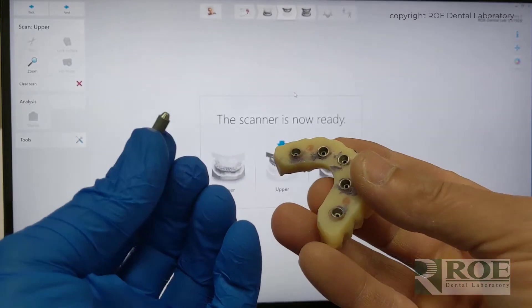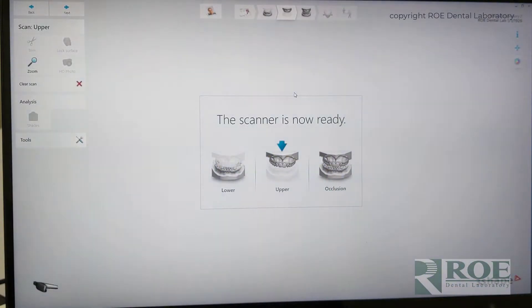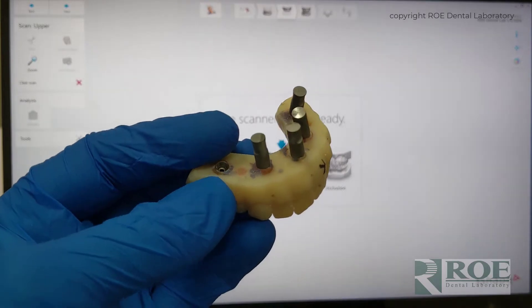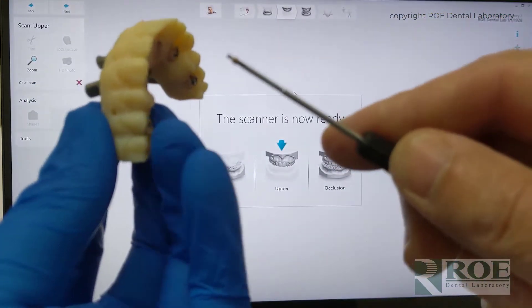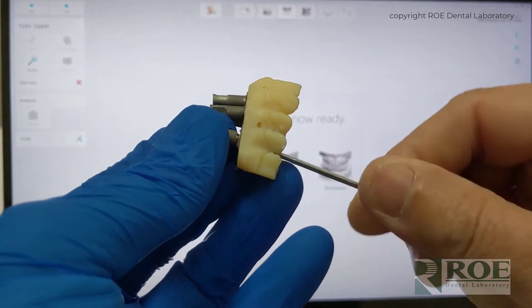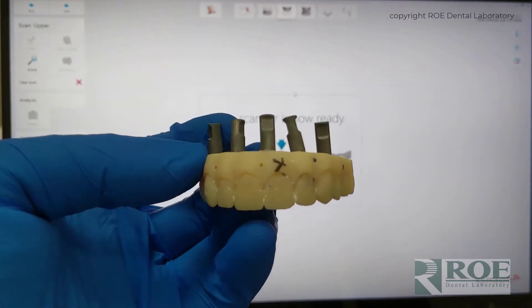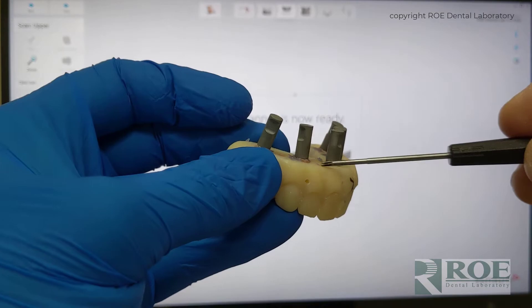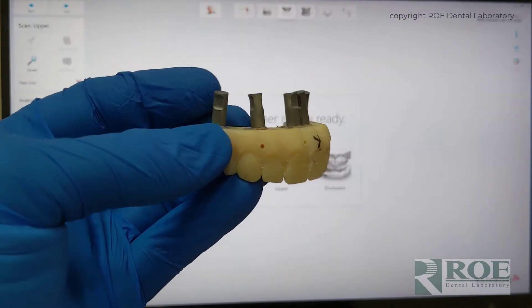So I'm going to assemble these. These are basic analogs. You'll need a prosthetic screw and simply screw them to the prosthetic, and then we'll scan. I've screwed in four of the five and I'm just going to add one more. You simply put the analog in the intaglio, put the prosthetic screw on, and just simply screw them together. Make them snug — you don't have to torque it. Make sure that they are fitting perfectly. One of the tricks is, before you do this, take a toothbrush or an ultrasonic and clean around those cylinders. They've been in the mouth for a while and could have some calculus. If these are held up by any material, it won't be passive.